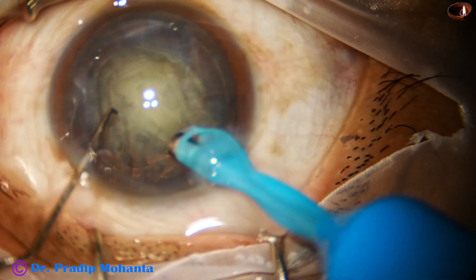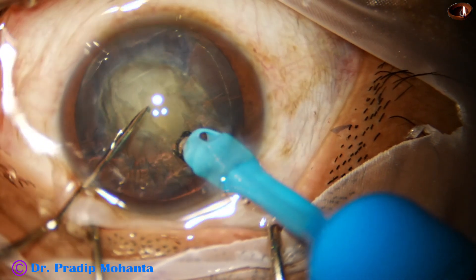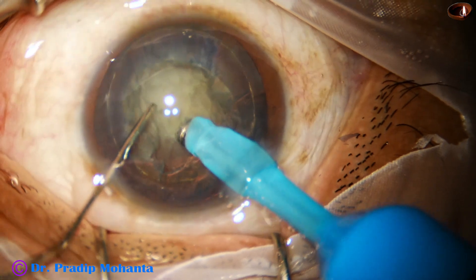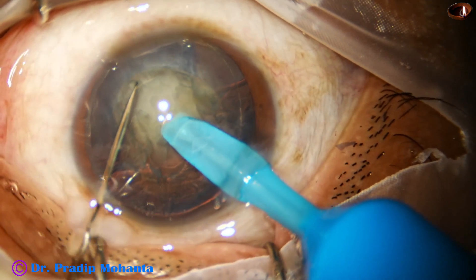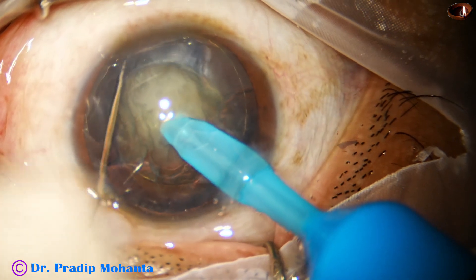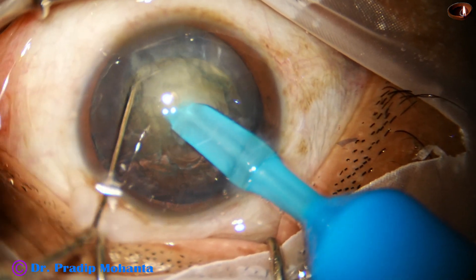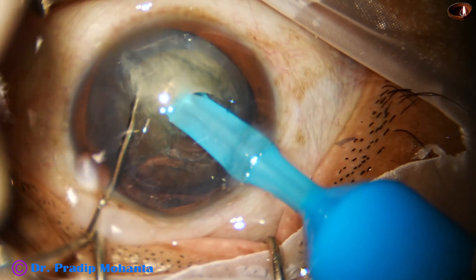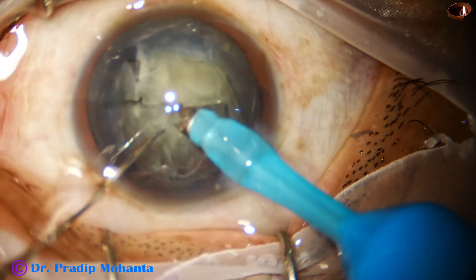The handpiece has been rotated by her and now the tip is buried in the substance of the nucleus. A nice hold is achieved, and then she uses the chopper to get a beautiful crack.